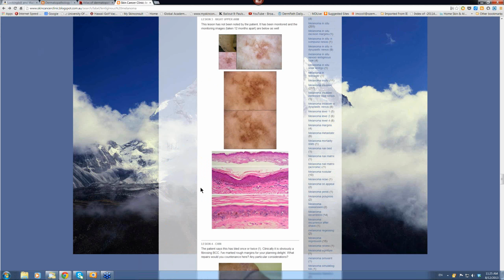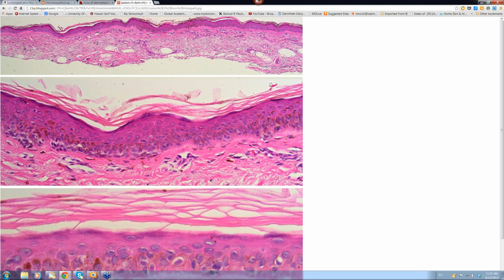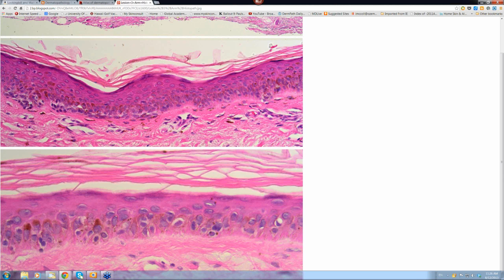Let's have a look at the histology. I think these are all courtesy of Dominic Wood at IQ Pathology. Again, let's make that a little bit bigger. You're looking along this dermo-epidermal junction here. It looks to be a bit of thickening of that epidermis anyway. Something happening at this level here. That's solar elastosis. It's a nice big shave that's been done. And as you come down, you start to see this abnormal proliferation of melanocytes at the base of the epidermis here. You can see the abnormal proliferation here. It's pretty subtle though, isn't it?